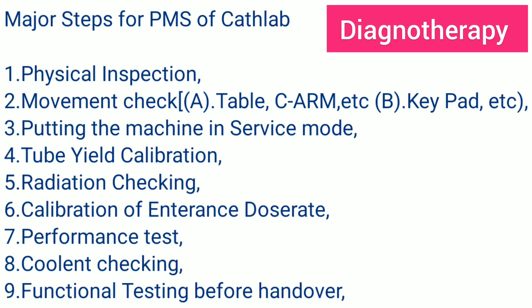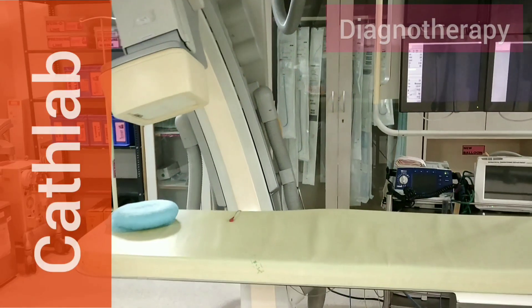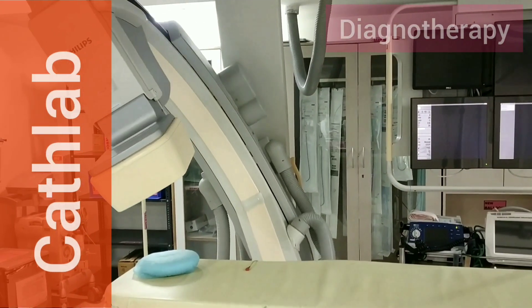Third, putting the machine in service mode. Fourth, tube yield calibration. Fifth, radiation checking. Sixth, calibration of entrance dose rate. Seventh, performance test. Eighth, coolant checking. Ninth, functional testing before handover. So let's see the cath lab — firstly we will be doing the physical inspection followed by movement checking.